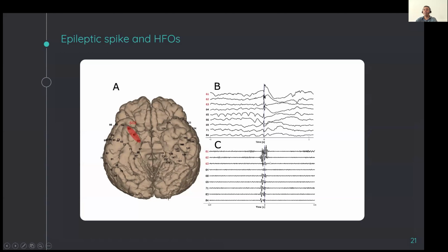In this experiment, we had 2 types of data with the same patient, using the drug and not using the drug. Here the below row is the case that didn't use the drug. A doctor used this drug to diminish the seizure rate when they are in the hospital. As we can see, for the patient who didn't use the drug, the rates are higher. Here we want to show that in any case we can detect the markers.